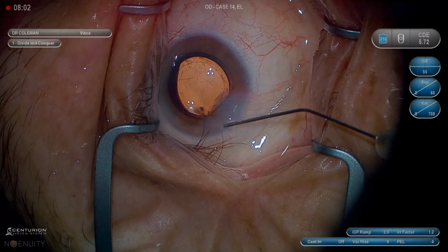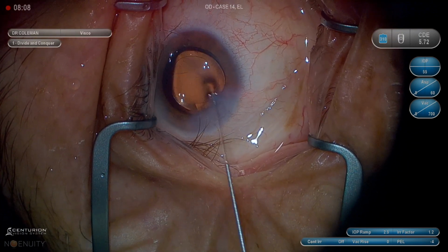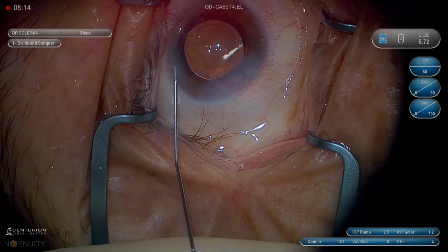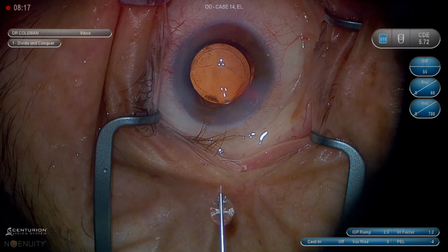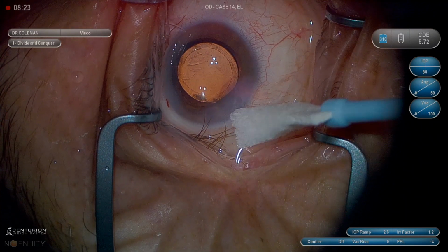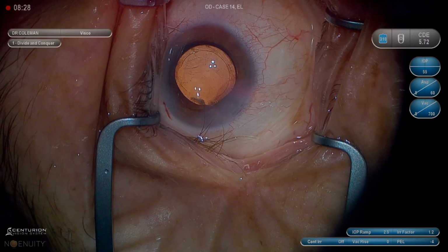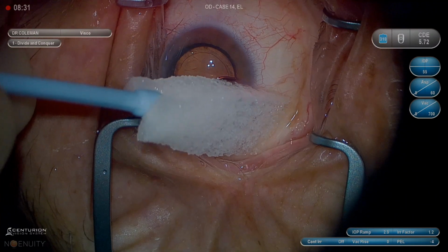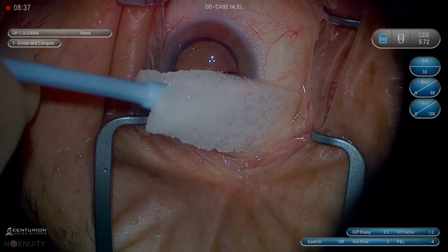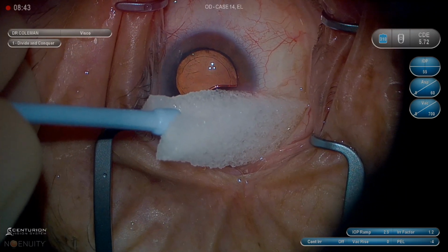And if you hold it on the wound for about a minute, the theory is that the relatively hypotonic tetracaine will flow into the relatively hypertonic corneal stroma in a diffuse way and hydrate in a way that you cannot do with BSS on a cannula. So the rule generally holds true, and we can see in this video that after multiple rounds of hydration, I've still got a little bit of leak in the wound. So here's a Weck-Cell soaked in tetracaine. You can warn the patient it may burn a little bit. And you hold it there for about a minute, and probably 80 or 90% of the time, when you thought you were going to have to place a stitch, this will do the trick.